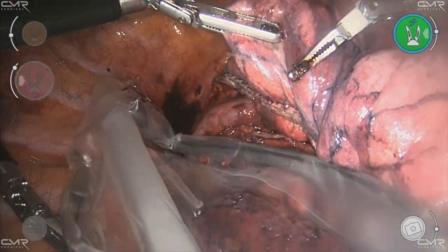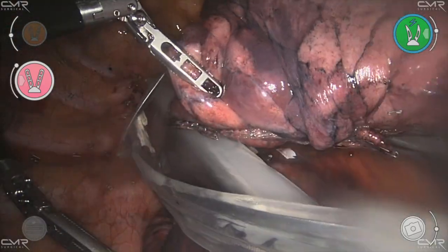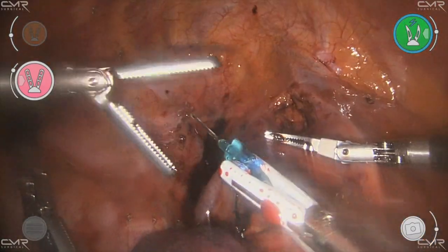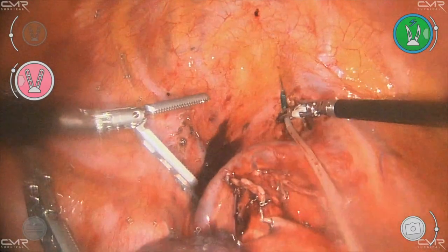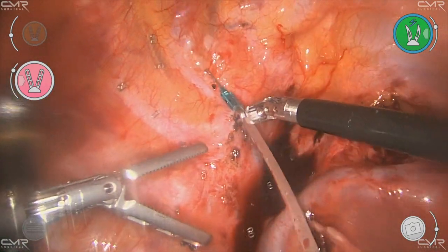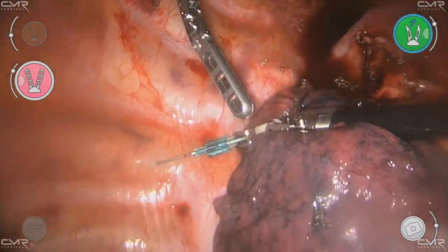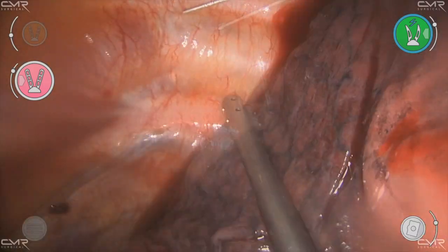Taking the specimen out with an Ender bag. The team also practiced emergency dedocking — it was phenomenally simple. With these little thin arms, it's very simple to unclick them and remove them in an emergency. There isn't a large massive robot above the patient, so it's almost trivially simple. The team were left thinking 'is that it?' when they did their emergency dedock — it really is that simple. The Papworth team, led by their expert thoracic anesthetist, are very meticulous about their blocks: paravertebral at the start of the operation, then high-volume local anesthetic with steroid in every single space from the first to the tenth, and also a phrenic nerve block — really does a great job of keeping the patient pain free.